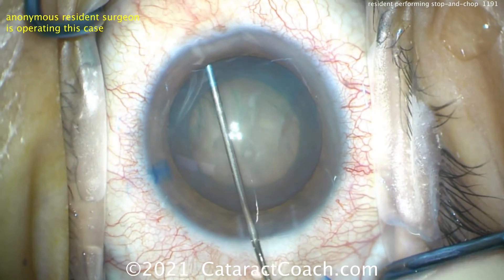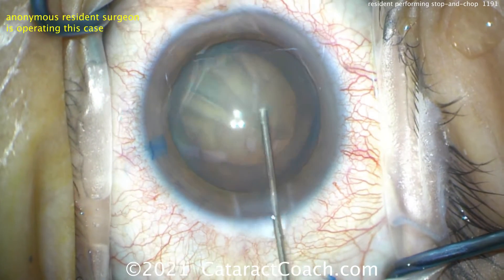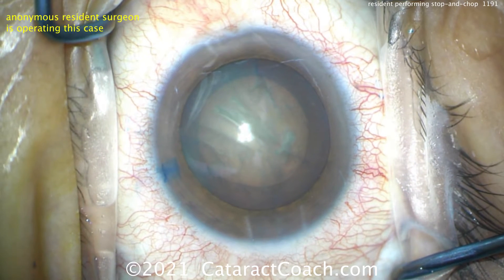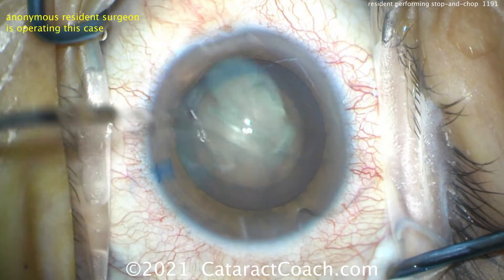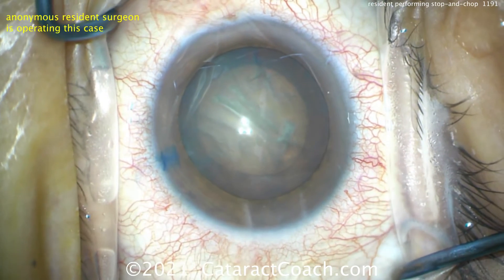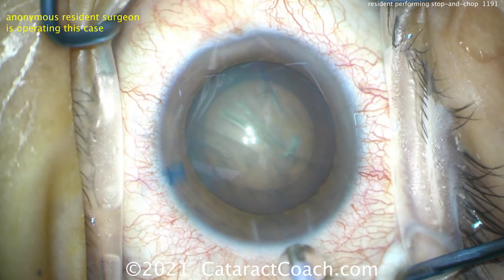The rhexis is about five, maybe five and a half millimeters in diameter. Good hydrodissection. You can tell the trypan blue dye was used. The nucleus spins — always a good sign. This resident has done about 200 cataract surgeries, so the technique is going to be pretty good. The draping is good, lashes are sequestered away, lid margins are tucked away. The main incision has a nice tunnel length — you can see the sides of the corneal stroma. The paracentesis placement looks great too.